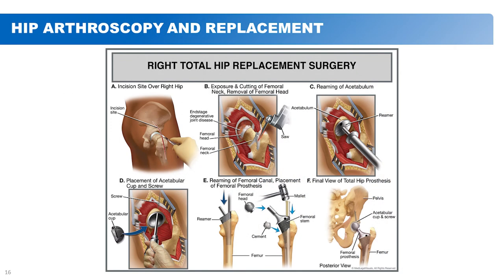The hip replacement surgery, you can see here just some medical slides kind of detailing more or less what we do. We go down, we mechanically remove all those spurs and the labrum, and we replace that socket. You can see kind of in pictures there, and then we go into the hollow of the thigh bone, and we ream or remove the inner part of the bone, and in the hollow of the thigh bone, place that stem and ball, and then snap everything in place. You keep your own muscles and tendons and everything around, and we've tried to find ways to spare those so that you can get a quicker rehab.